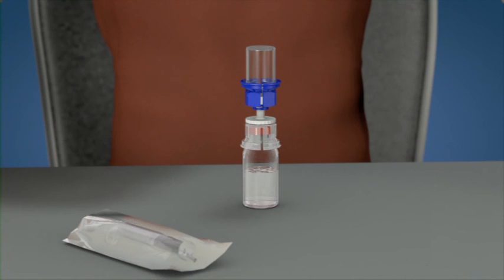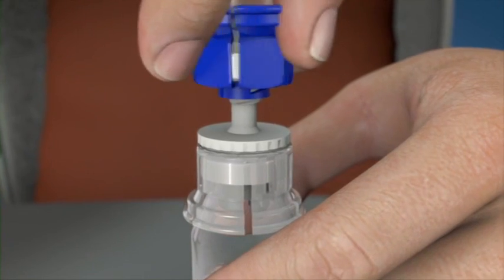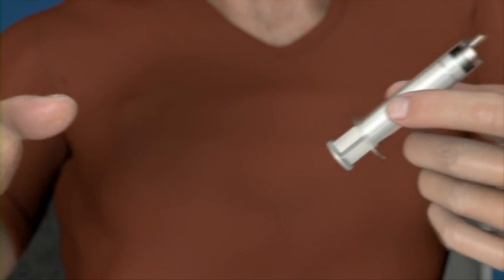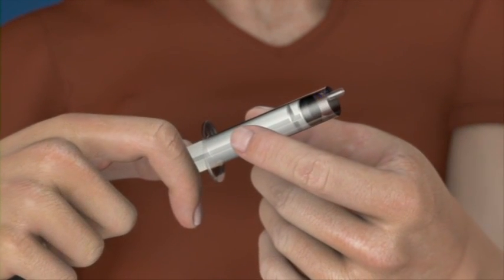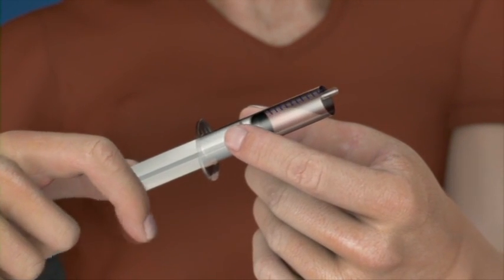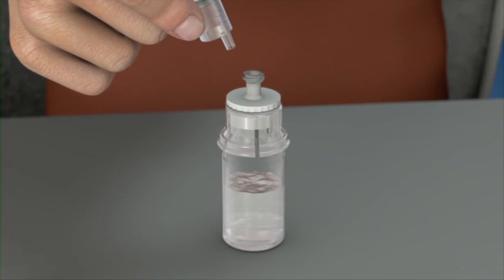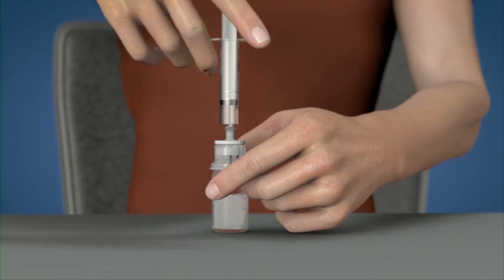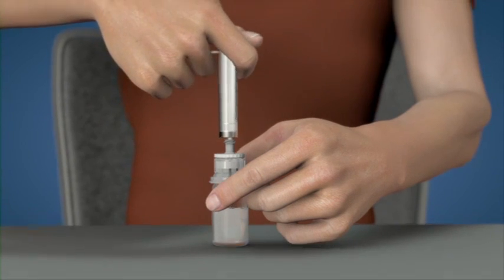With one hand, grasp the product side of the Mix2 Vial set, and with the other hand, grasp the diluent side of the Mix2 Vial set. Unscrew the set into two pieces. Draw air into an empty, sterile syringe. While the product vial is upright, connect the syringe to the Mix2 Vial set and inject air into the product vial.